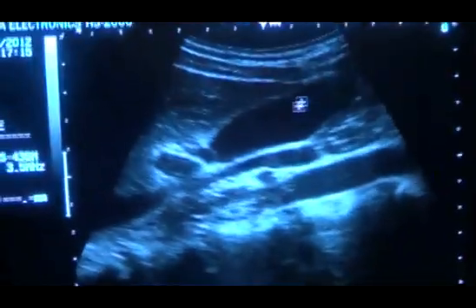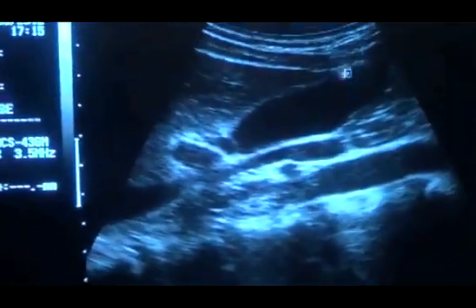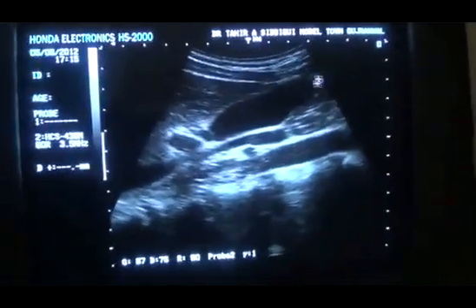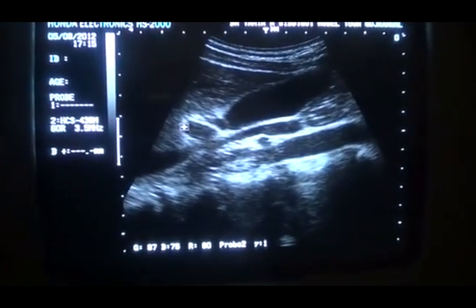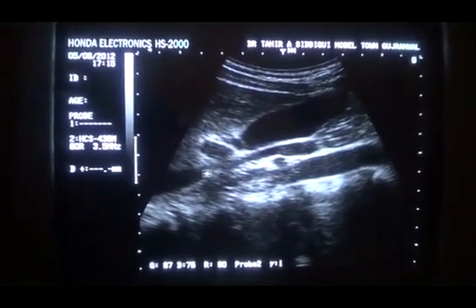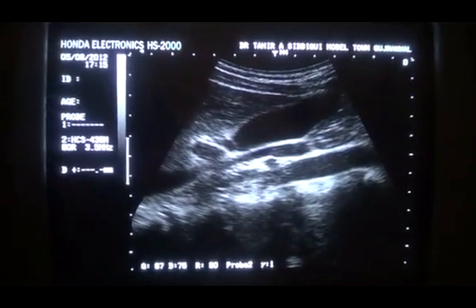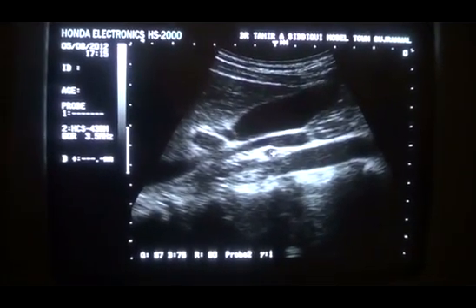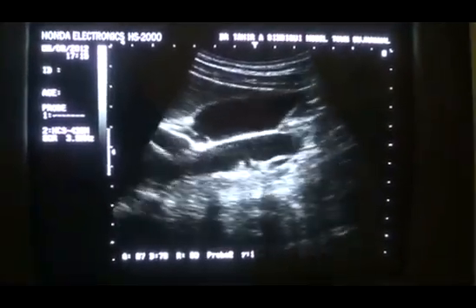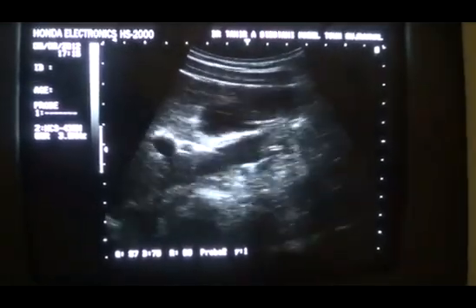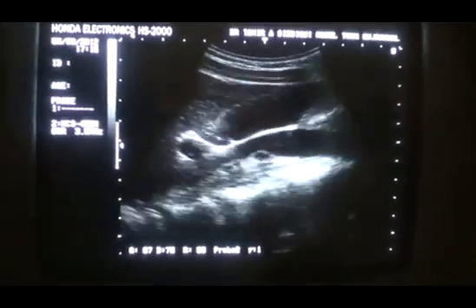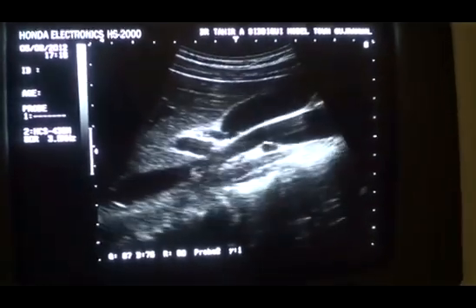In this particular patient, this is the fundus of the gallbladder — you can't miss a stone in this region. We are seeing the fundus with the body, anterior wall, and posterior wall. This is the inferior vena cava, this is the aorta, and this is the right renal artery in transverse section. These are the scanning plans for the gallbladder. At times, if you feel problems, you may have to ask the patient to stand up and scan so that the viscera come down and you can locate the gallbladder.